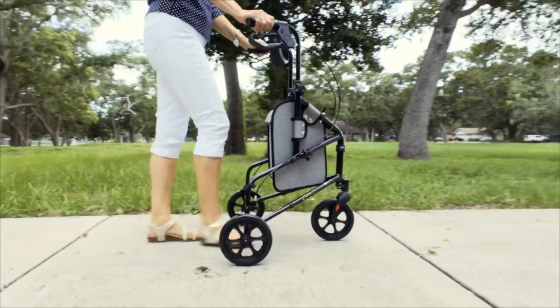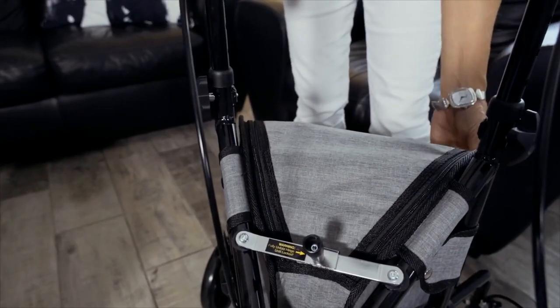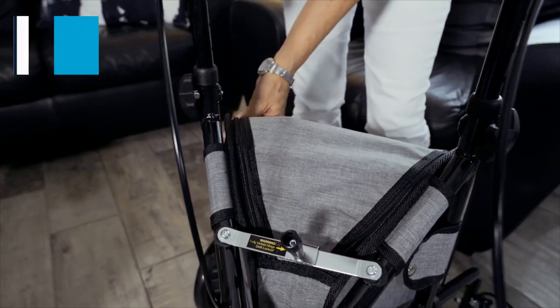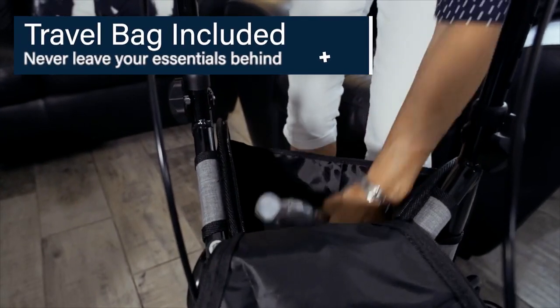making it easier for you to be outside without worrying about the integrity of your Rollator. The three wheel Rollator includes a removable travel bag for you to safely store a purse or wallet, electronic devices, medications, and other essential items you may have.